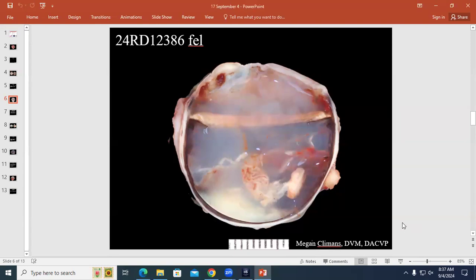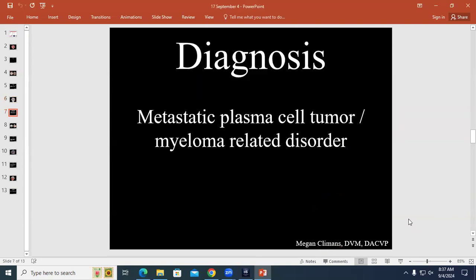But I think it's more in terms of it's a descriptive term. It's not a diagnostic term. So more subjective. Maybe it might be better to say in this case that the multifocal and extensive distribution inside the eye is suggestive of metastatic disease in this case, rather than specific.